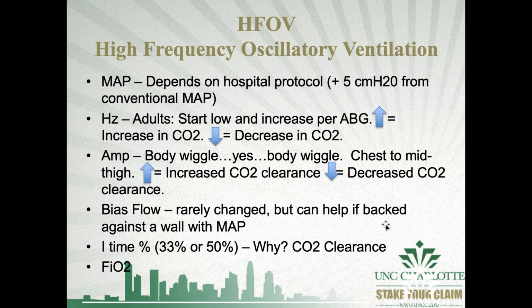Now the way hertz is defined is that, instead of breaths per minute, think of it as breaths per second. So if I set my patient at 6 hertz, how many breaths per minute am I giving that patient? I'm giving that patient 360 breaths per minute, okay?